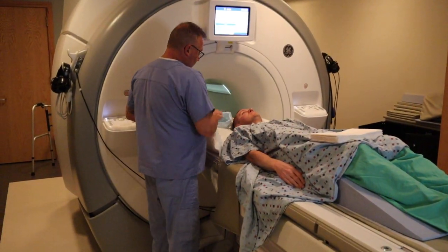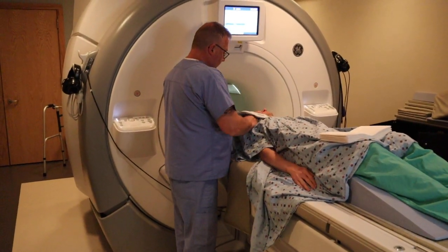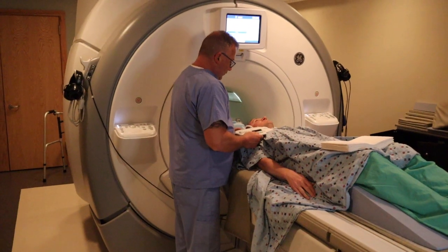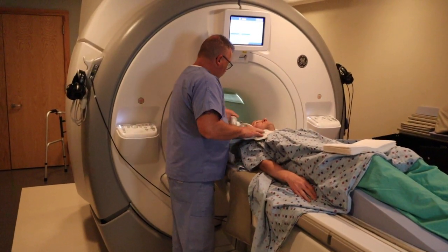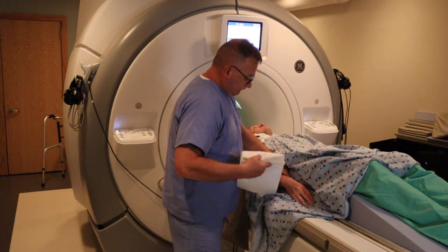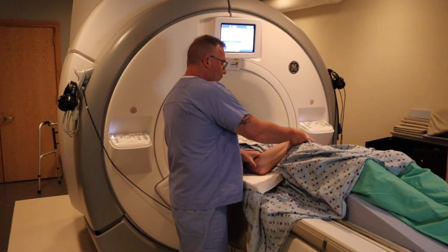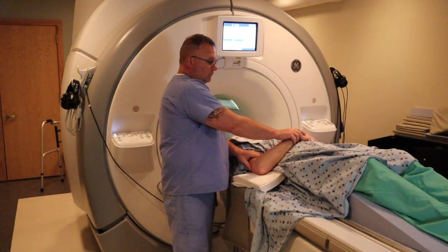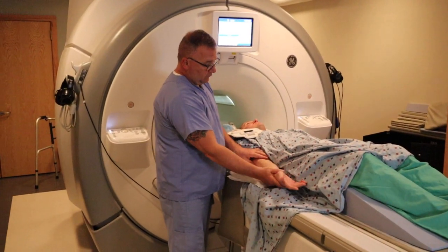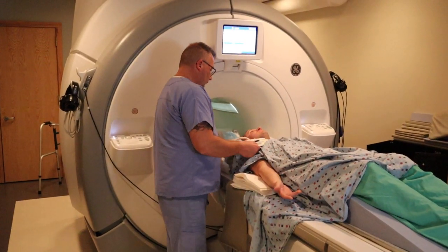You want to ensure that the shoulder is on plane, so that on the axial images it cuts right through the humerus in profile. You want to wrap the coil from the top of the shoulder down, and you want to have the arm extended out with the palmar side up to open up the shoulder joint.